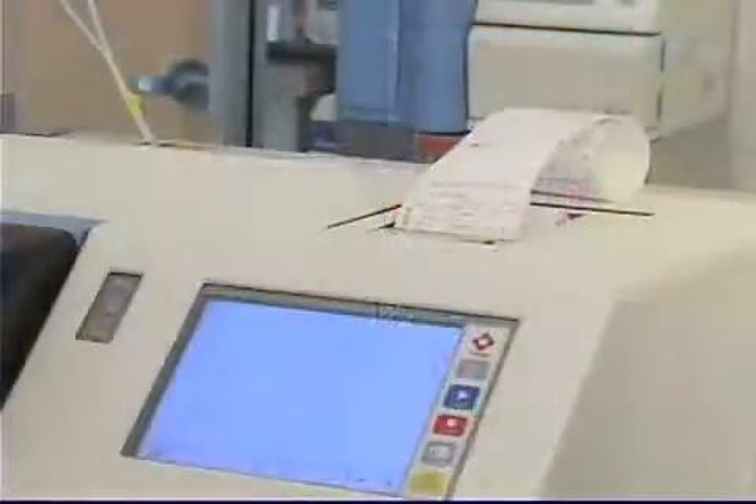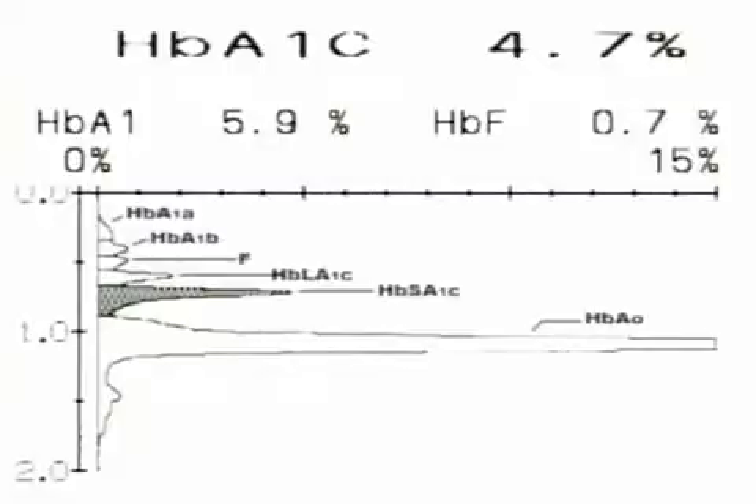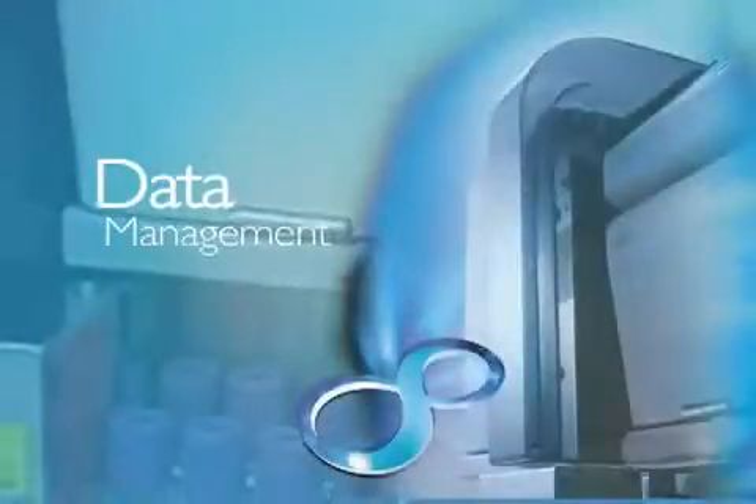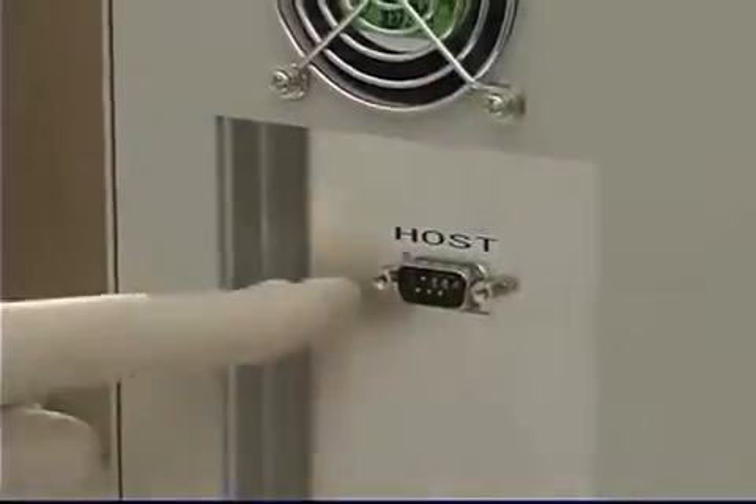Results, including chromatograms, print out automatically at only 1.6 minutes per sample for hemoglobin A1c with excellent peak resolution. Data may be stored to a smart media card or transferred to an LIS via either unidirectional or bidirectional interface.